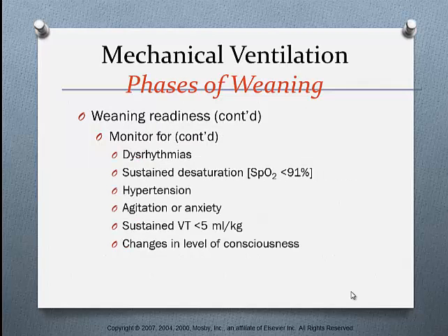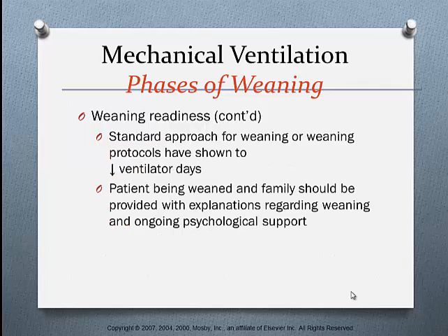Monitor the patient for tachypnea and tachycardia. Also monitor the patient for dysrhythmias, desaturation below 91%, hypertension, agitation and anxiety, a sustained tidal volume below 5 mL per kilogram, and changes in level of consciousness. The standard approach, or weaning protocols, have been shown to decrease ventilator days.